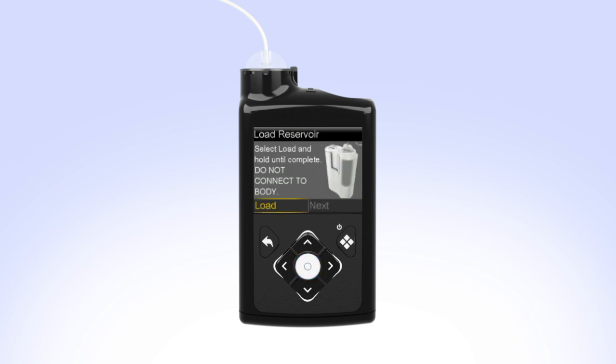With Load highlighted, press and keep holding Select until the screen shows Complete. When you see Complete, do not connect to body, and a yellow checkmark on the screen — select Next.